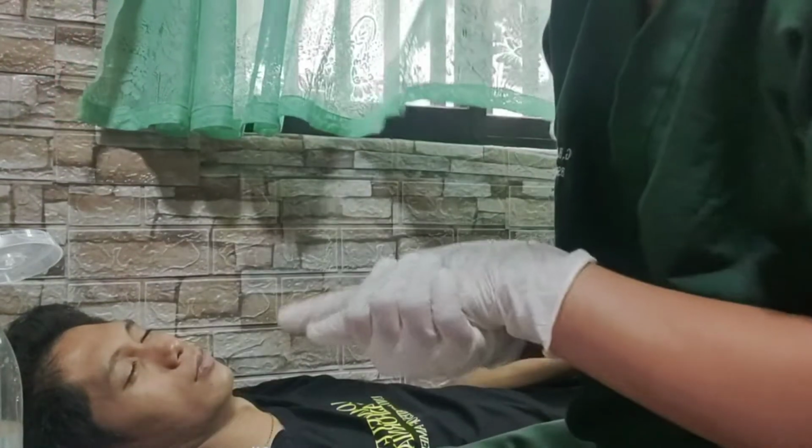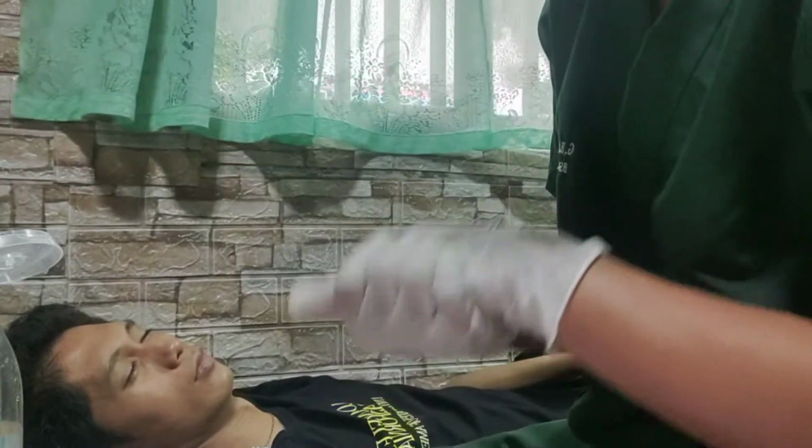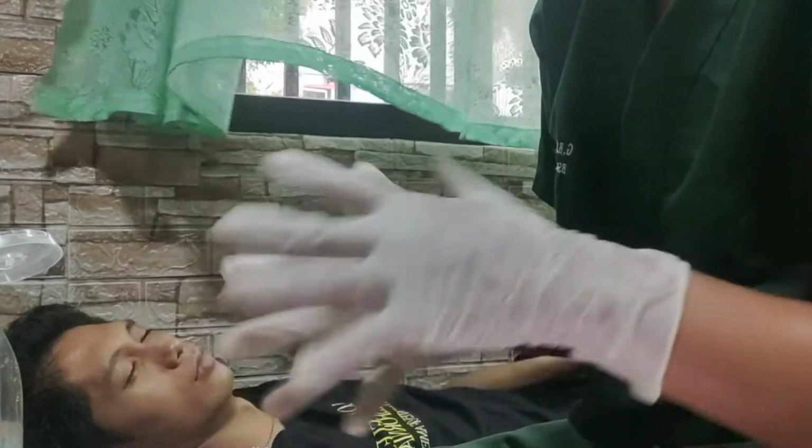Then, document the kind and amount of fluid used and its effectiveness. Next will be the ear irrigation. So, same procedure as the eye irrigation. We need to identify first the client and explain the procedure, what we're going to do to the client. And also, gather the materials for our procedure.